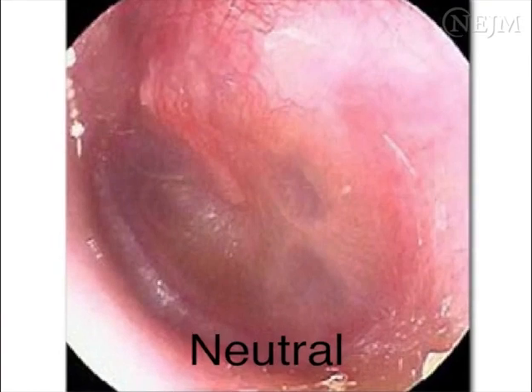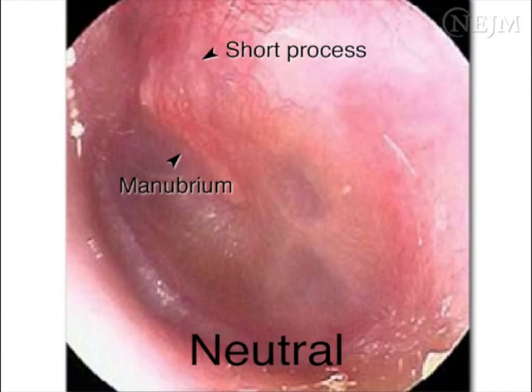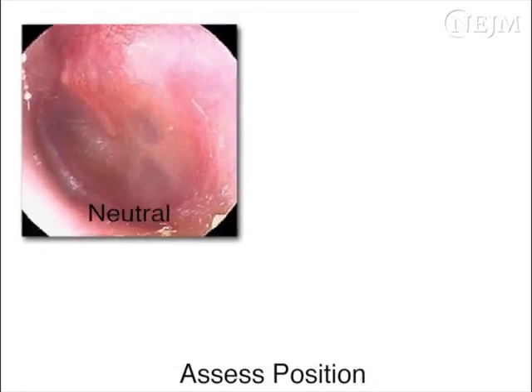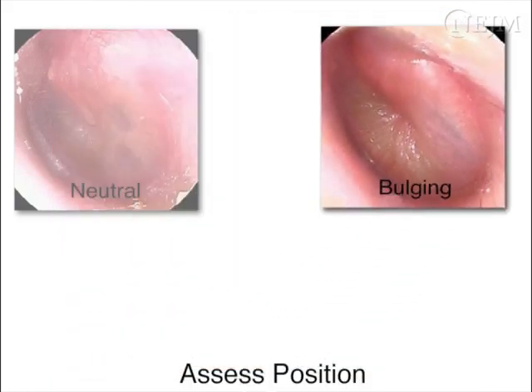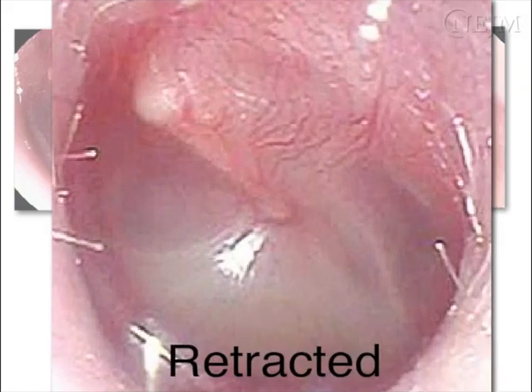Assess the position of the tympanic membrane by visualizing the manubrium and short process of the malleus. When the tympanic membrane is in the neutral position, the manubrium and the short process are clearly visible. When the tympanic membrane is bulging, the short process is not visible and the tympanic membrane appears convex. When the tympanic membrane is retracted, the manubrium appears foreshortened and the short process appears prominent.